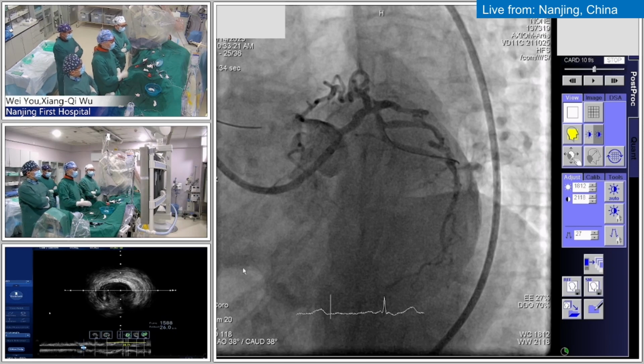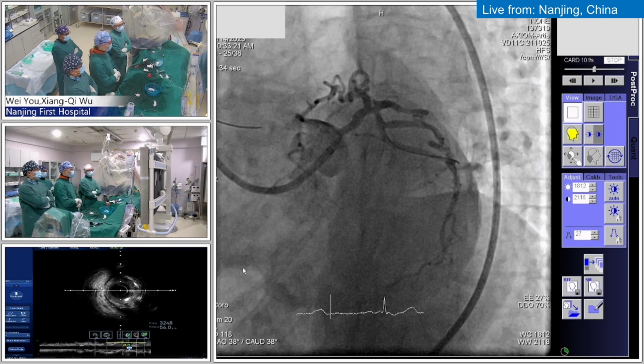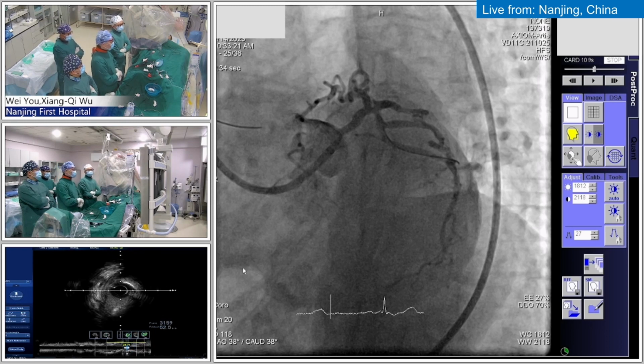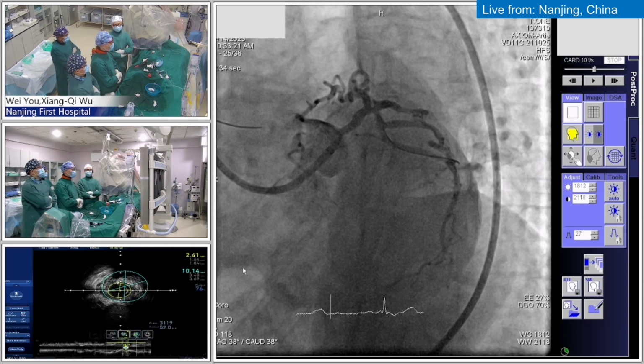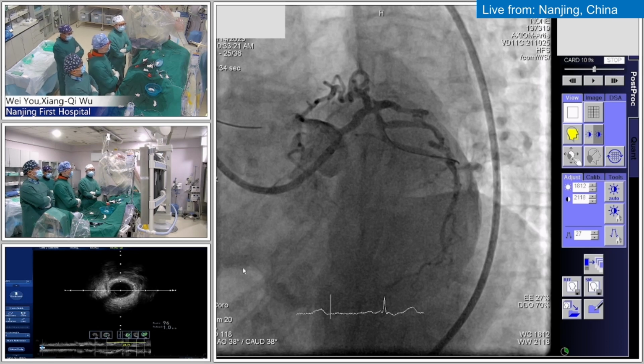Left main bifurcation case, which to me, the most impressive part was this is a 72-year-old patient, but minimal calcification, at least by angiography, which to everybody is a straightforward predictor of how the outcome is going to be. Something like this, we can get absolutely pristine results. I'm also at the Mecca, the world's best center of DK crush. I'm sure that is going to be the approach that would be used, and we'll take you through the various steps. So with that, my initial introduction, I'm happy to put the case back to the operators.